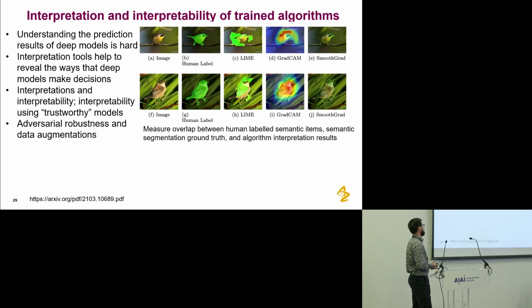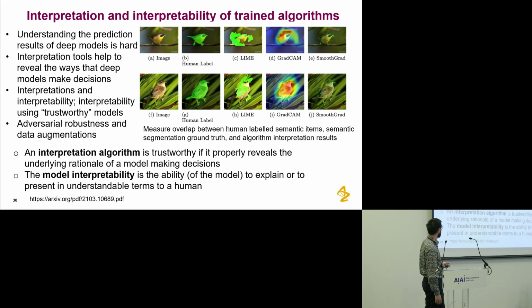As I mentioned, it's very hard to interpret digital pathology predictions, because the model predicts something. If you have ground truth, it's great. You can say it's cancer, no cancer. But what did the model learn? In our case, we work very closely with pathologists, but at the same time, we are exploring different advanced methods, trying to see how the model reacts to adversarial attacks, or if we change something in the input. I think Phil covered this topic also quite well yesterday.